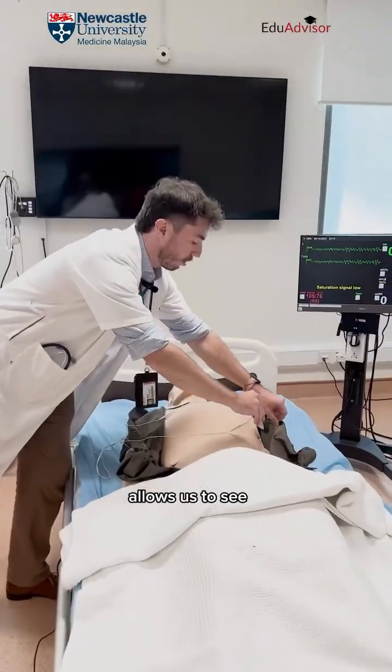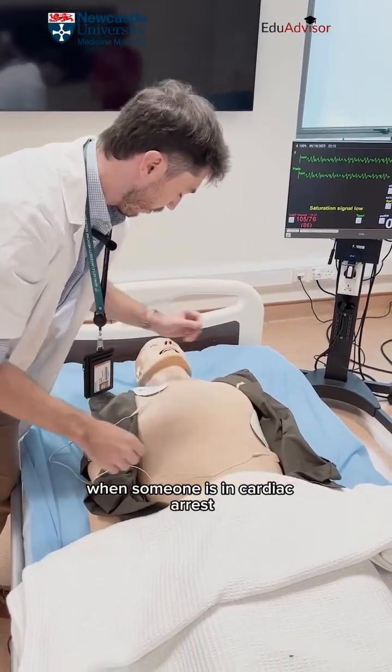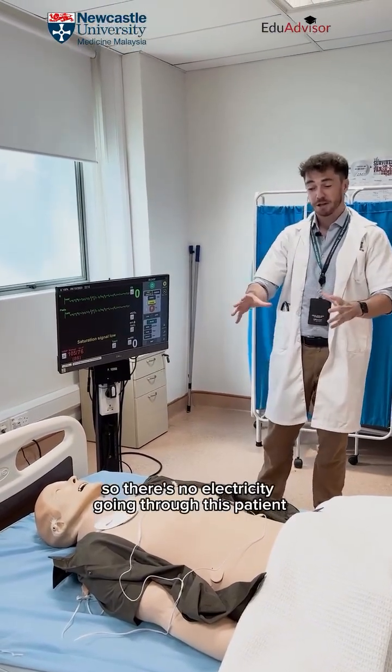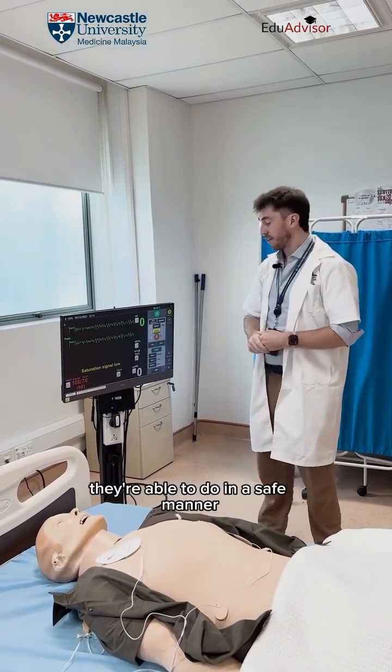The pads stick on the chest and allow us to see what rhythm the heart is in when someone is in cardiac arrest. Students can learn how to deliver a shock safely, because it is quite a dangerous part of real life. With no electricity going through the patient during practice, the students are safe, and when they go to the wards they're able to do it in a safe manner.